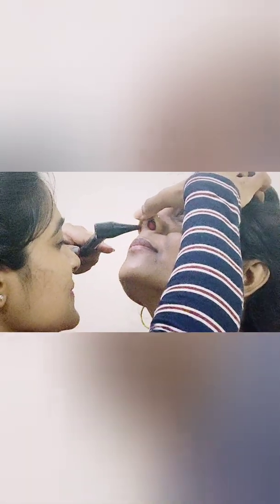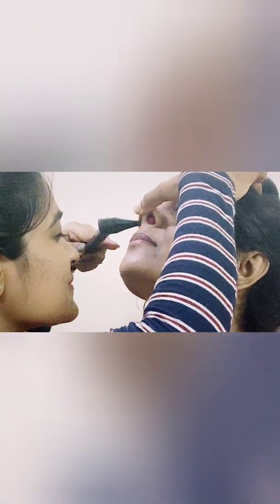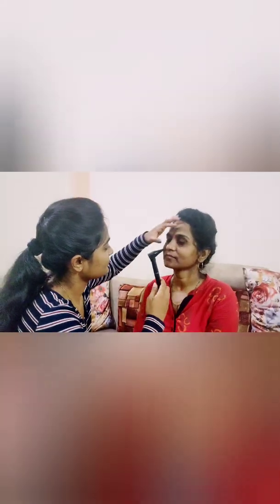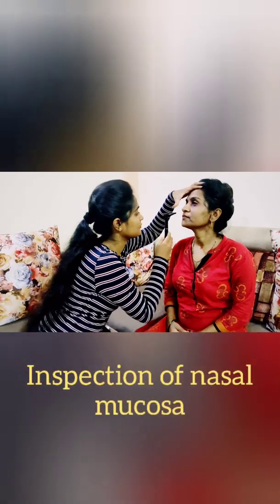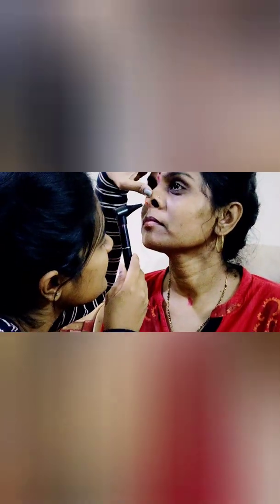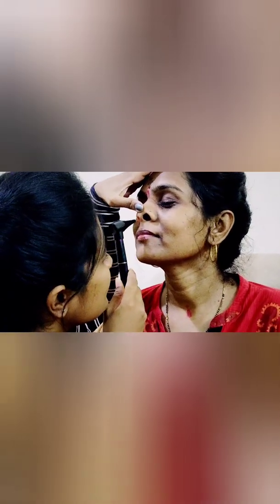By directing the speculum posteriorly, then upward in small steps, try to see the inferior and middle turbinates, the nasal septum, and the narrow nasal passage between them. Some asymmetry of two sides is normal. Inspect your nasal mucosa. Note the color, any swelling, bleeding, or exudate of the nasal mucosa. If any exudate is present, note its character, whether it is clear, mucopurulent, or purulent.